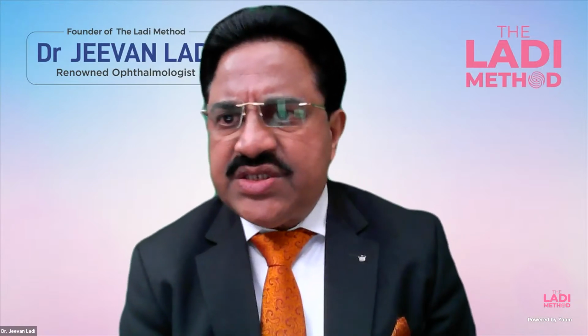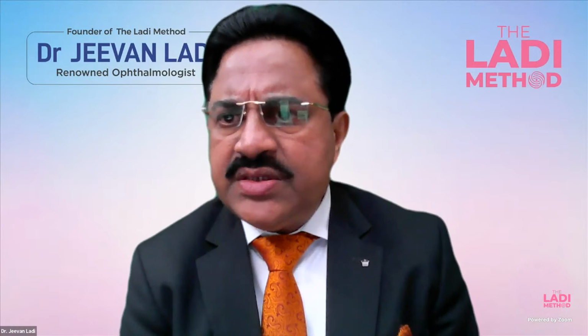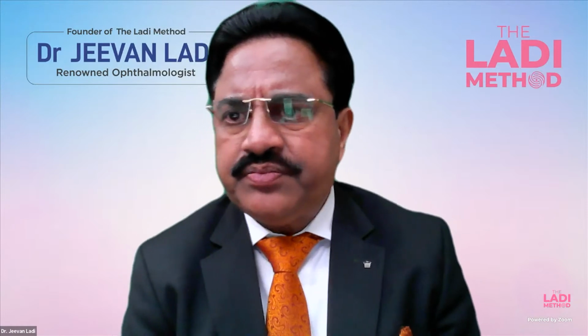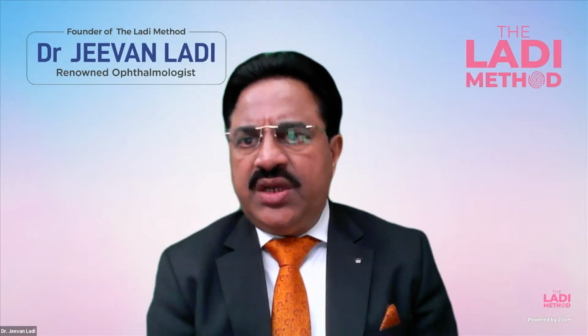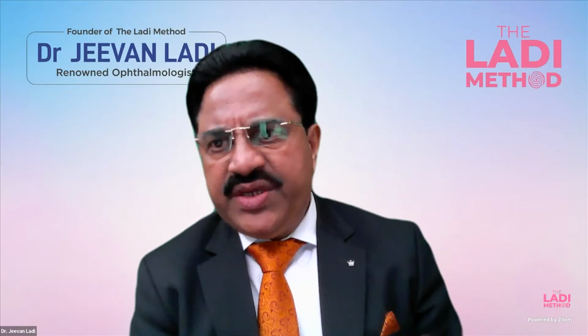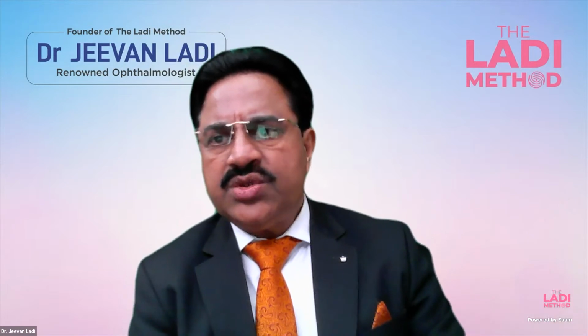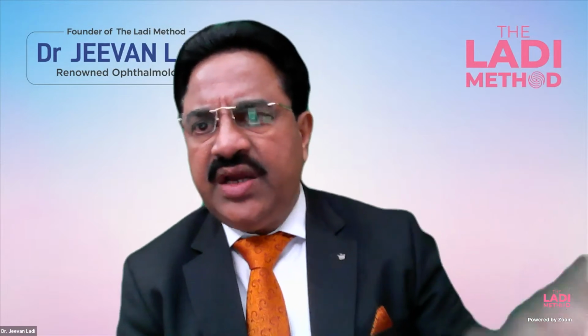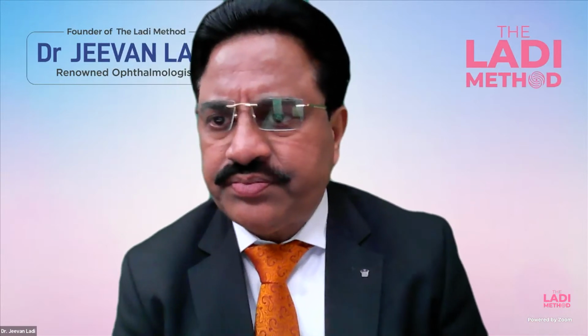The simple thing which I said in my talk is that the only one simple thing which needs to be done is a calibration of your machine. The machine which we are using, each day before we start the session, there's a compulsory calibration mode. So unless that is done and we get an acquisition green signal from them, we cannot proceed.